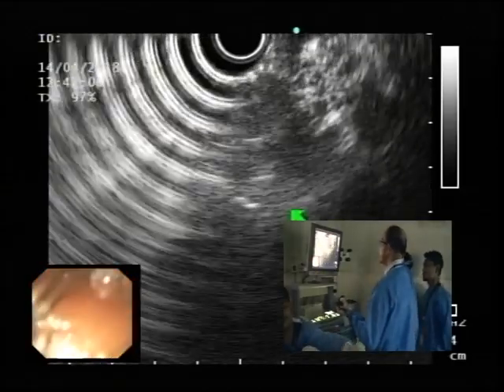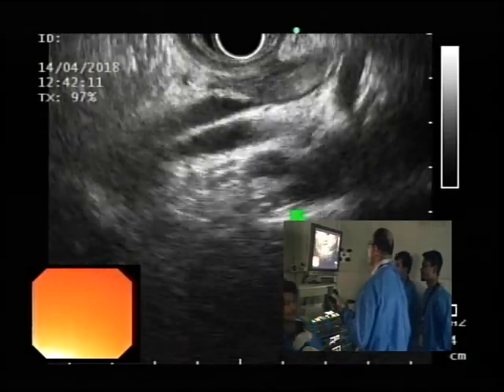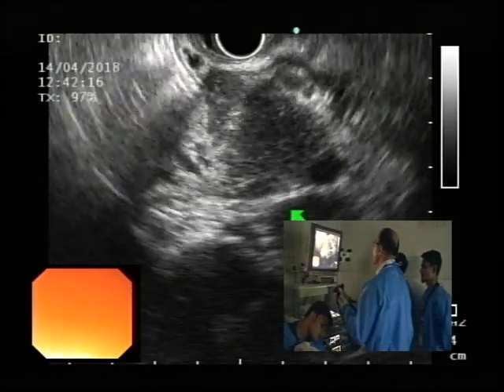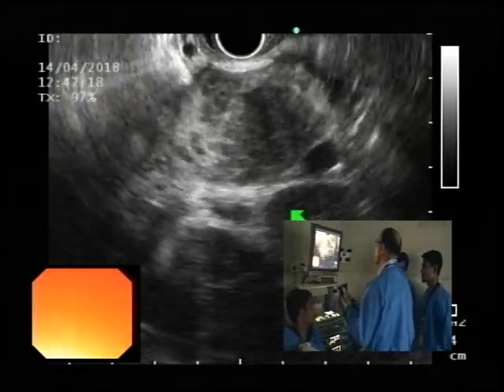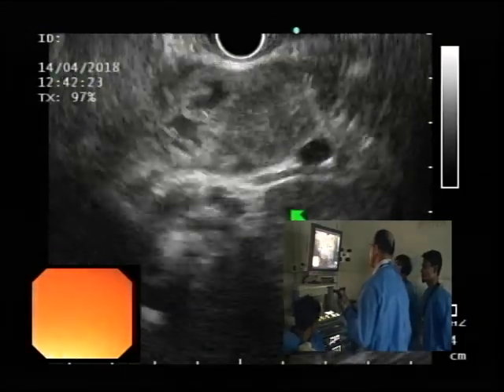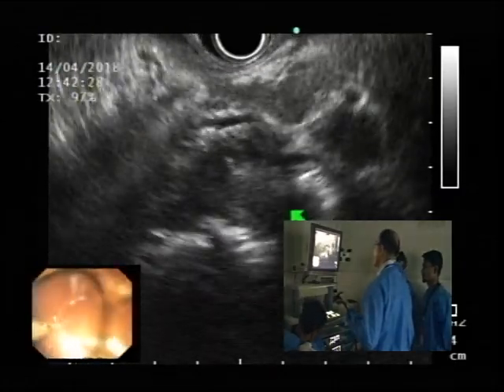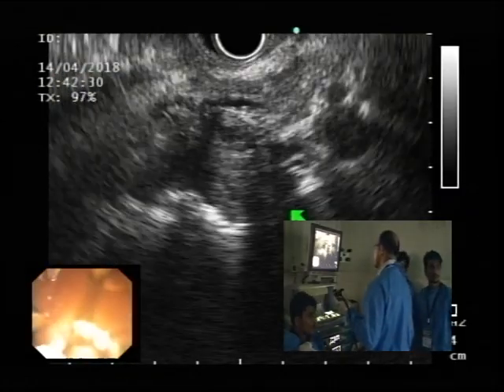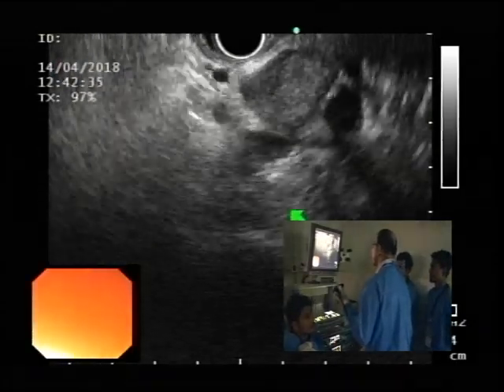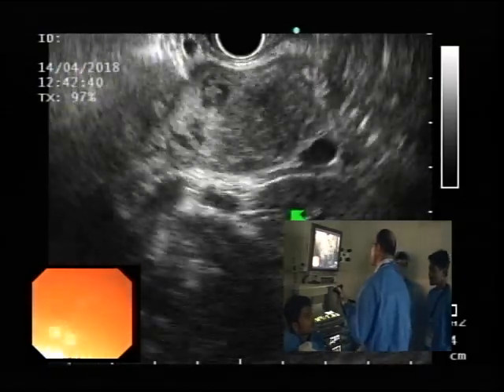In that area, and in the body tail, which we are back at now, it's actually hypoechoic, almost mass-like here. So the differentiation here is: is this chronic pancreatitis or is this a neoplasm? That's what I wondered. Of course, in an older person, the money would be on it being a neoplasm. While this could be that, in a 17-year-old I would be more in favor of this being significant, very marked pancreatitis.